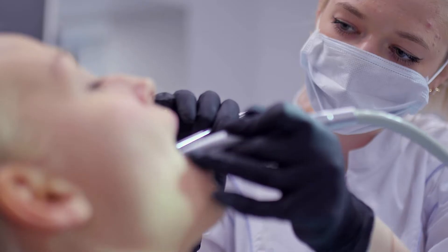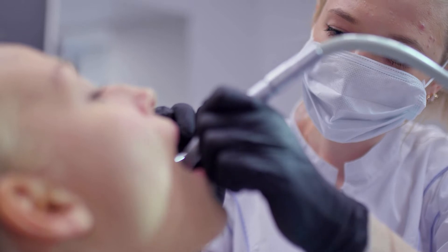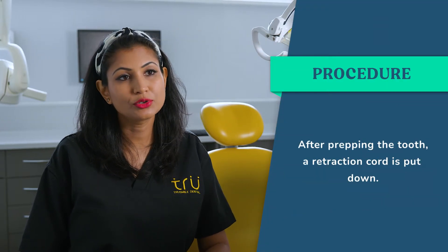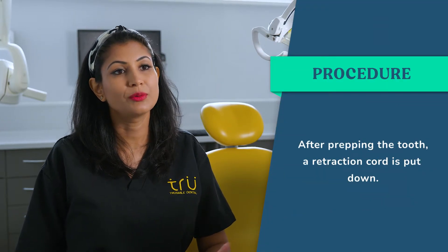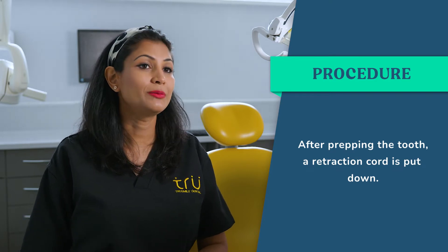The nurse will be there, and there may be quite a lot of water. If you need to take breaks in between, just raise your hand and let your dentist know. After the prep part of the tooth is completed, your dentist will put a retraction cord down around the tooth to push the gums away from the tooth and to help stop any bleeding if the gums are bleeding in the area.